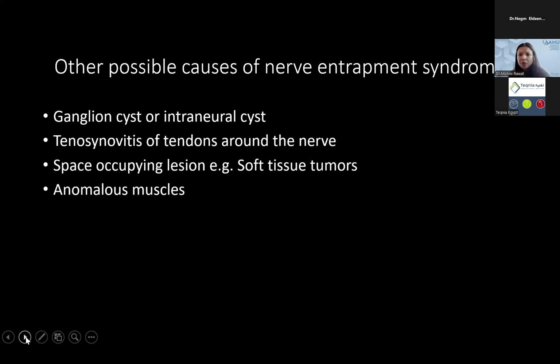Let's say if that muscle was not a concern in the way it works and the action of that muscle, it's very well just like any muscle in the human body. So with anomalous muscle, you have to be careful. Not every anomalous muscle is a normal finding, or not a potential source of pathology.